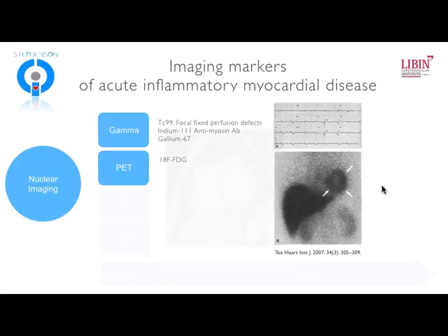value. Now, technetium would essentially show fixed perfusion abnormalities consistent with areas where there's very little perfusion with either necrosis or scar. That can be argued as to how much value there is in differentiating versus, say, an ischemic injury. But gallium had the potential to actually identify areas with increased metabolic activity associated with activation of the immune cell lines. So that actually had some early promise.